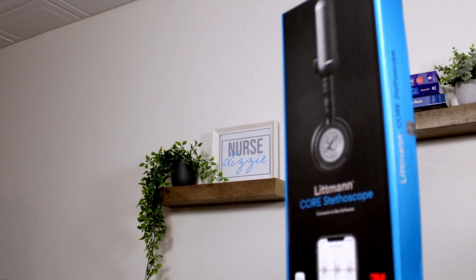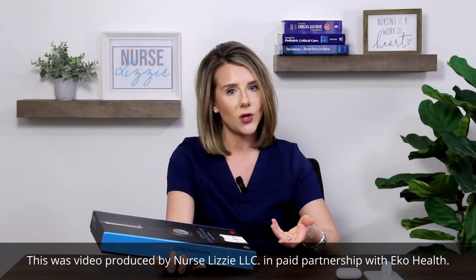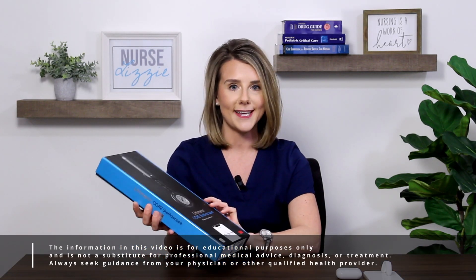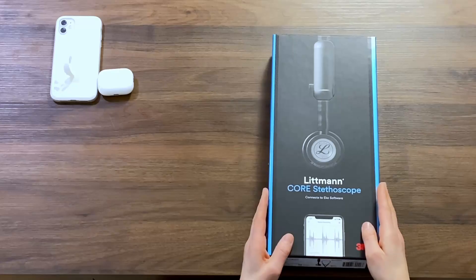Just like when I did my previous review with the Eko digital attachment, you do have to go ahead and charge that prior to use. So if you want to learn more about that, I will link that video below. The only thing I went ahead and did was charge this stethoscope so that I'm able to show you on camera. I can't wait to dive in, so let's go ahead and open up this Littmann CORE stethoscope.